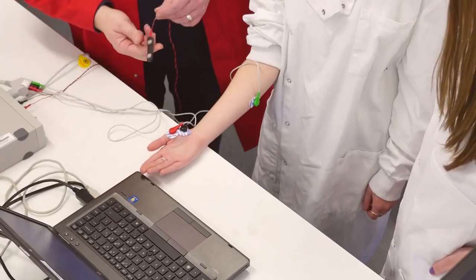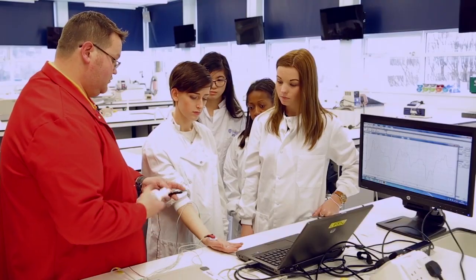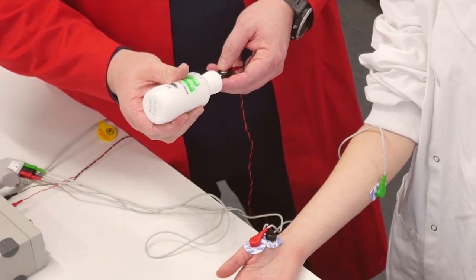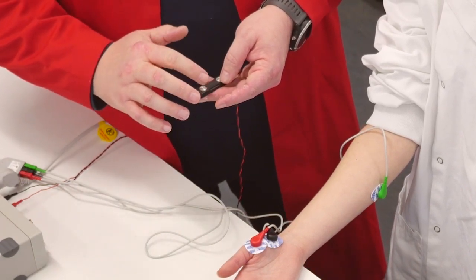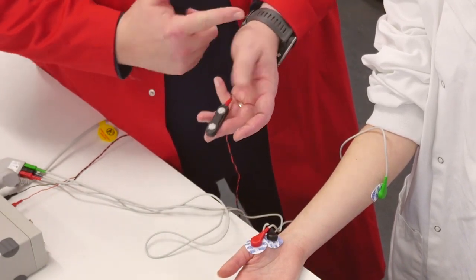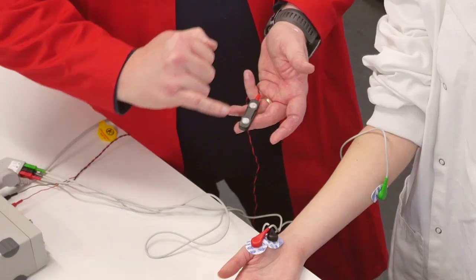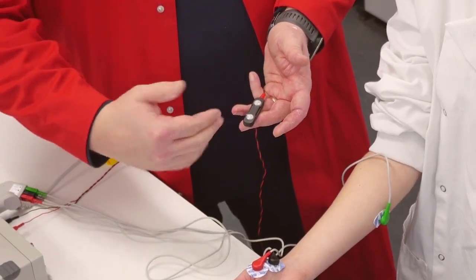We'll take our stimulating bar and use a conductive cream just to ensure that we get a good transfer of the stimulus potential. You don't want to use too much, because if you use too much cream the stimulus ends up arcing across and it doesn't actually penetrate down into the tissue.